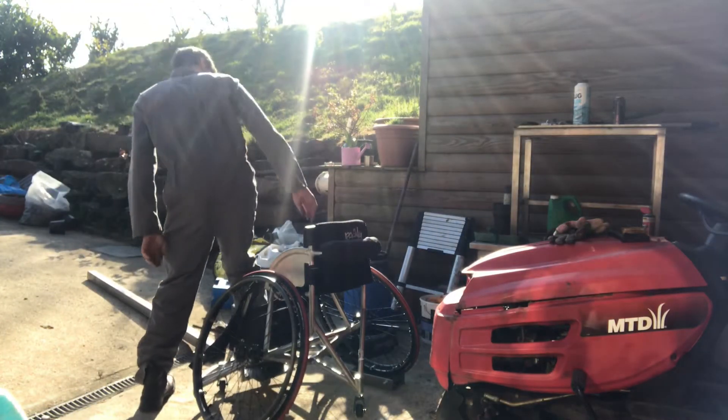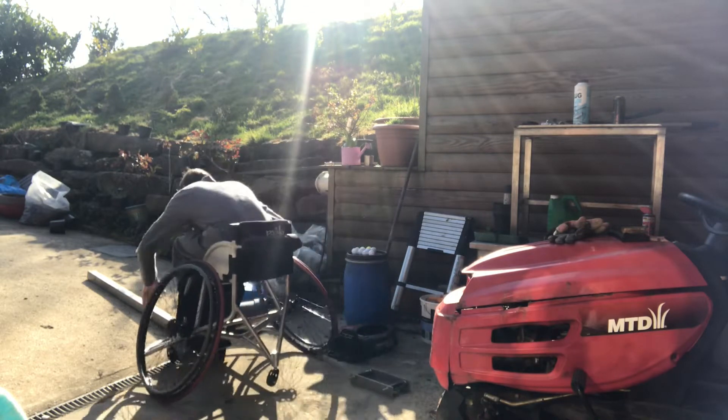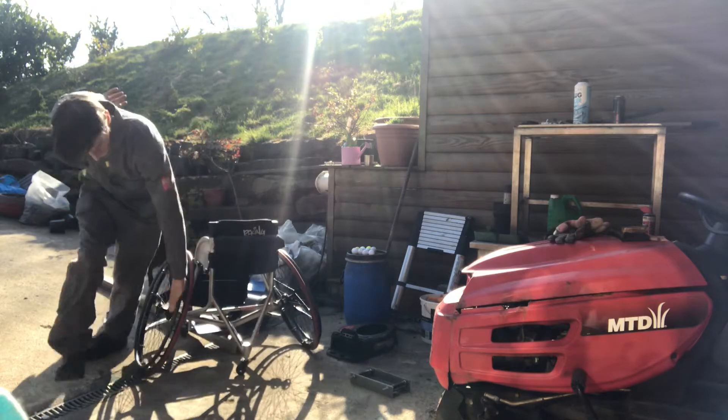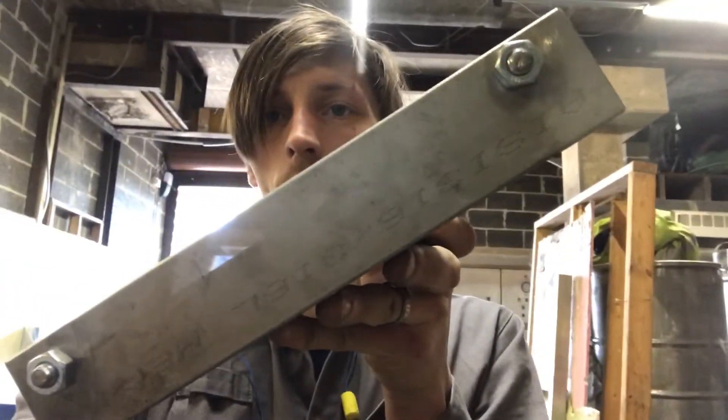Moment of truth. Back to the drawing board — the first one didn't quite work. I keep rolling off. So what we're going to try and do is, rather than have it set up flat like this, tilt it up at the front so that we don't roll the chair off the front of it. See if that works.